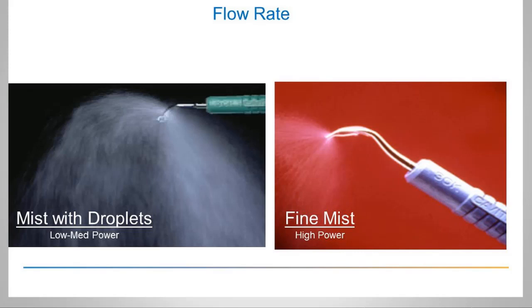What this means is when you boost to high power, the droplet atomizes, creating only a mist. The loss of potential cavitation and microstreaming effects in high power is not relevant, as cavitation and microstreaming do not enhance calculus removal. They enhance biofilm removal.